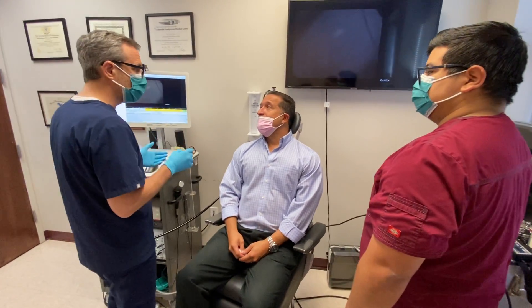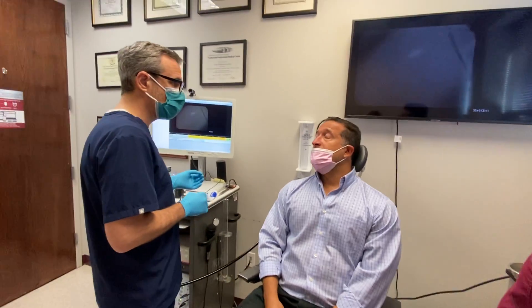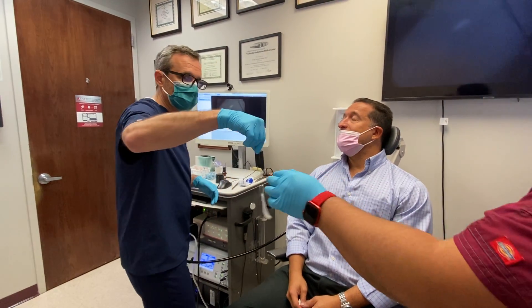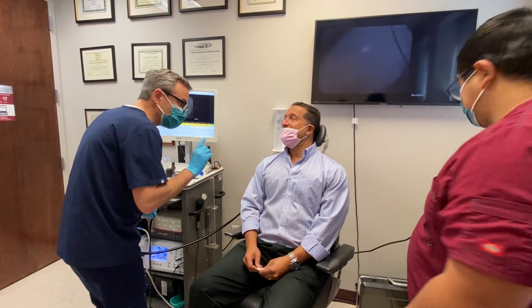So now what we're going to do is take a look through the nose. The camera I'm going to use is slightly larger than the other camera you had before, but you have a lot of numbing medicine, so you really won't feel all that much. It's a little uncomfortable, not terrible, and as I said earlier, I've done this to myself, so I do know how it feels.